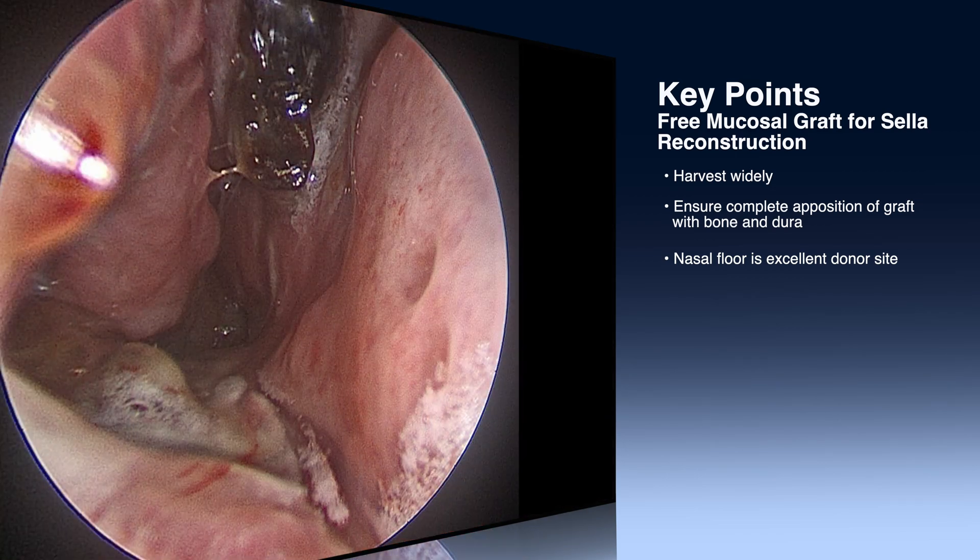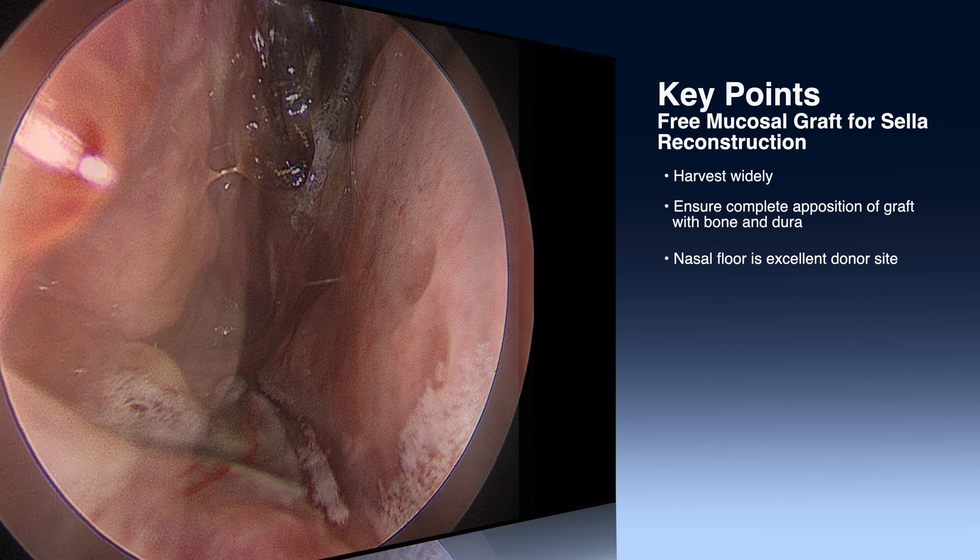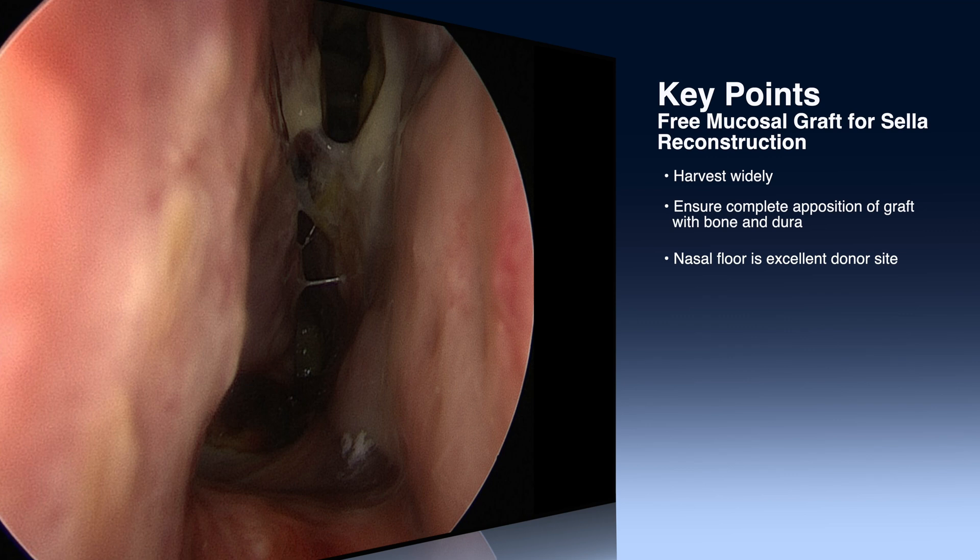The third major point or benefit of a free mucosal graft is that the donor site heals remarkably well. It tends to have a nice, moisturized environment from the inferior turbinate. It heals much quicker with less morbidity than a traditional nasal septal flap. It is, of course, best used for sellar defects with low to moderate CSF leaks. In larger defects, skull base defects, or high-flow leaks, we are of course typically still using vascularized reconstructive options.